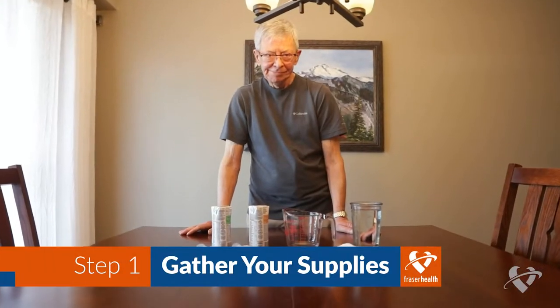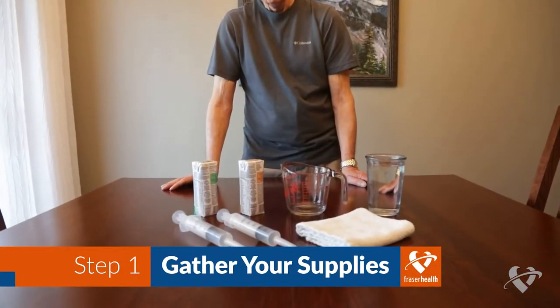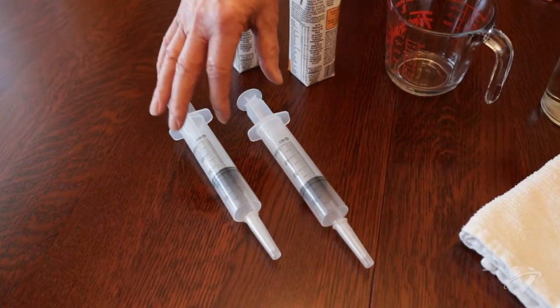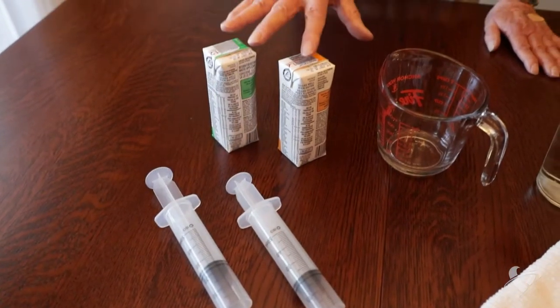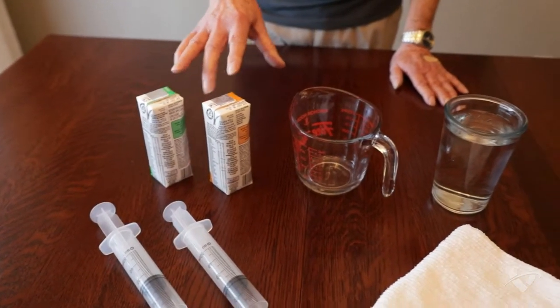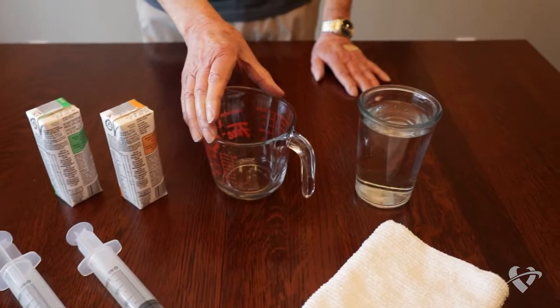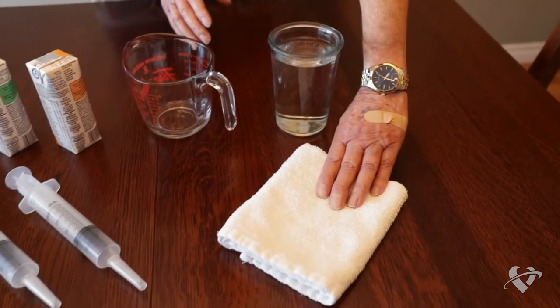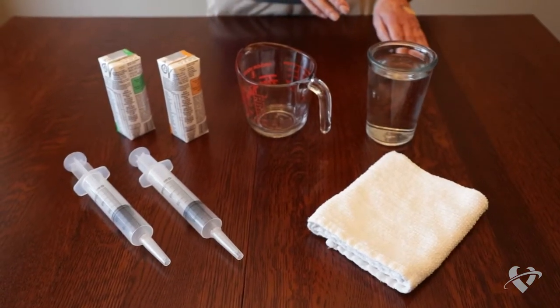To make the process easier, gather all of your supplies before you begin your feeding. You will need two syringes, your formula, a measuring cup, a container filled with room temperature tap water, and a small towel to cover your lap to catch any drips or small spills.